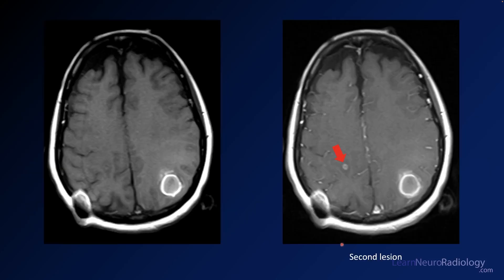You also see some gradient echo effect in that other lesion, confirming there's a lesion there — so there are at least two lesions in this patient. On the pre- and post-contrast, the second lesion on the right side is enhancing because it's not bright on the pre-contrast. However, the dominant lesion is predominantly T1 hyperintense because of the blood products — it really looks mostly like T1 intrinsic hyperintensity from blood.